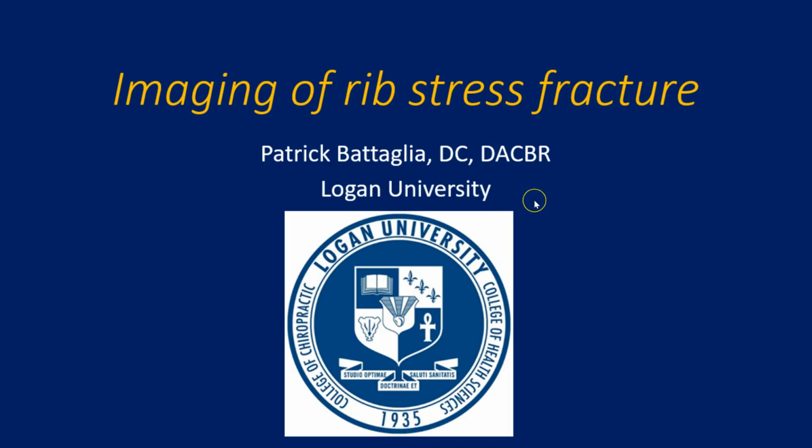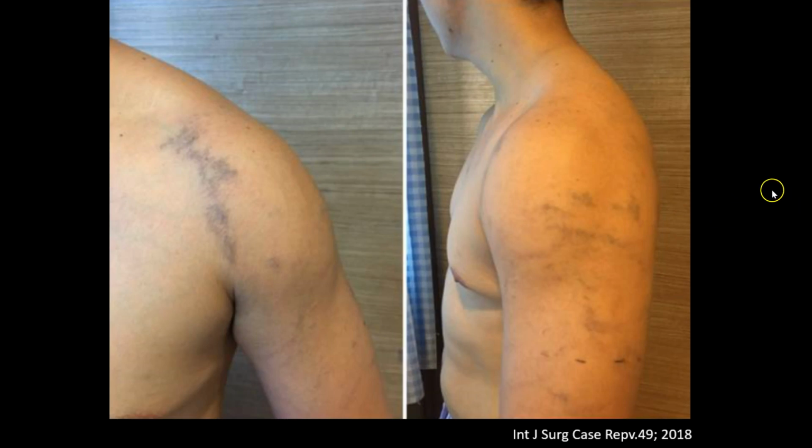This is imaging of rib stress fracture. I'm Pat Battaglia from Logan University. I thought I'd start this lecture with a case from the literature.